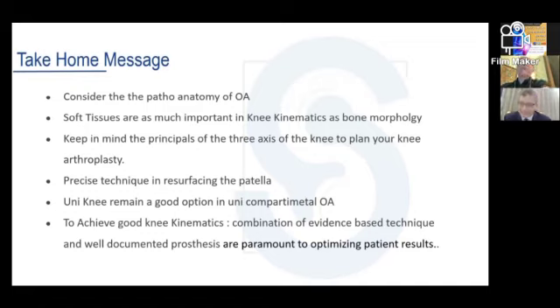From your long experience, sir, how can I preoperatively determine if I have a patient with osteoarthritis of the knee and ligamentous laxity? How can I determine preoperatively that this patient will be a candidate for a constrained knee or semi-constrained knee or just the straightforward ordinary knee? Is it possible to be determined preoperatively, sir?